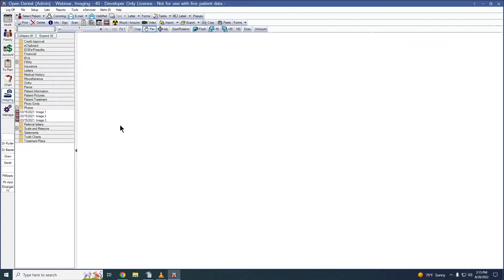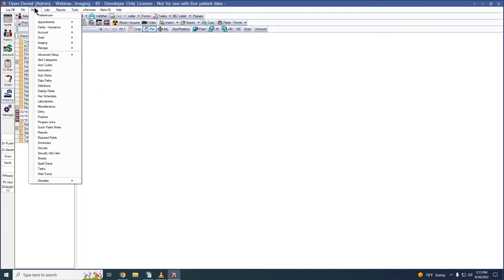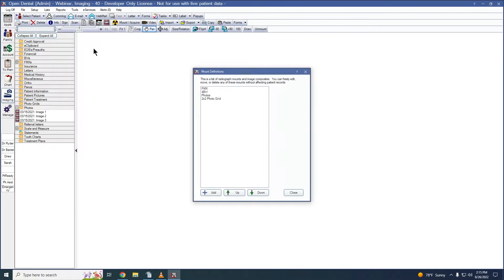Next, let's look at how to create a mount. A mount is used when taking multiple images or radiographs. To create a new mount, go to the main menu to Setup, Imaging, and Mounts. You'll see a list of your existing mounts and you can double-click into one to edit, or you can click Add to create a new mount.